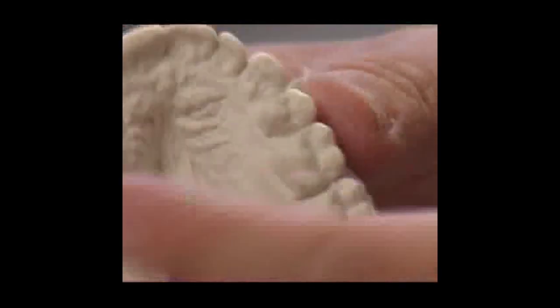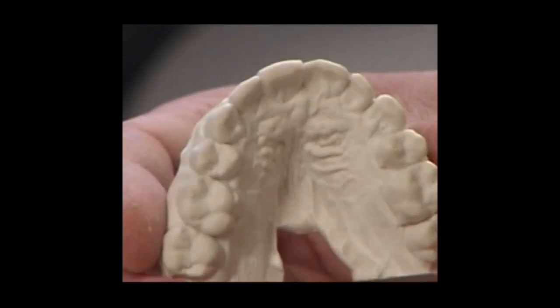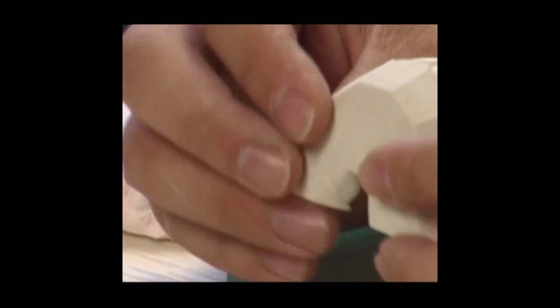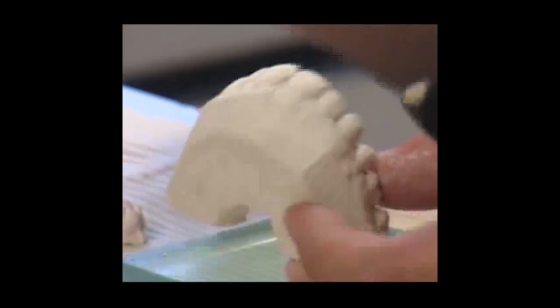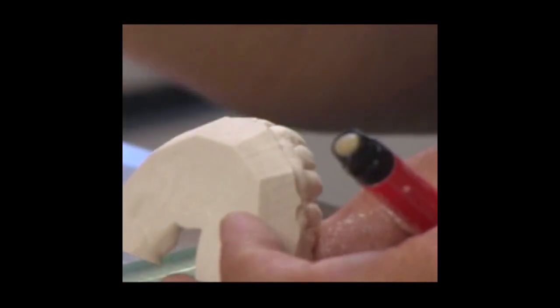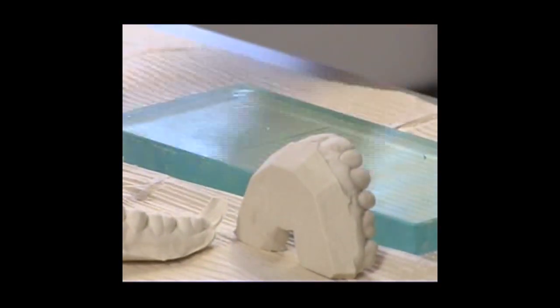All right, make it just simple. I don't want to go through too much detail. So just remove the created arch to make an even surface from the occlusal view. And now I'm going to apply the composite to mock up the design. This is a critical area where the laboratory is involved, because we as a laboratory know what the outcome is, and you can see it in a patient's mouth, but you have to translate that into the model. That's what I do.